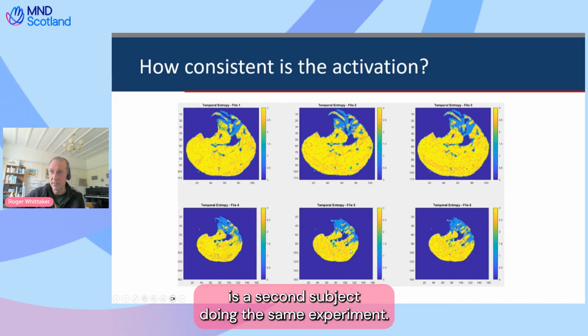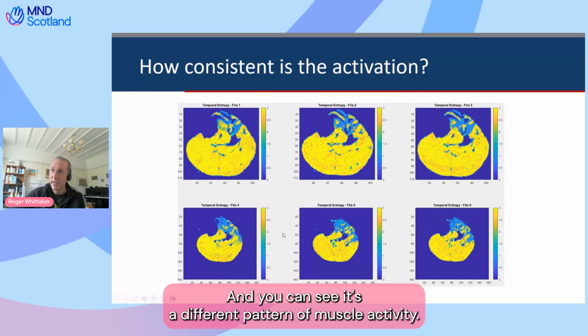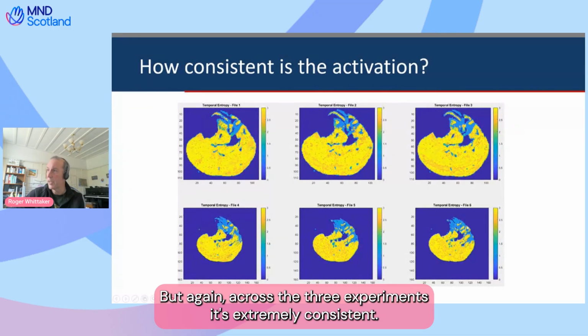Beneath that is a second subject doing the same experiment, and you can see it's a different pattern of muscle activity, but again, across the 3 experiments, it's extremely consistent.